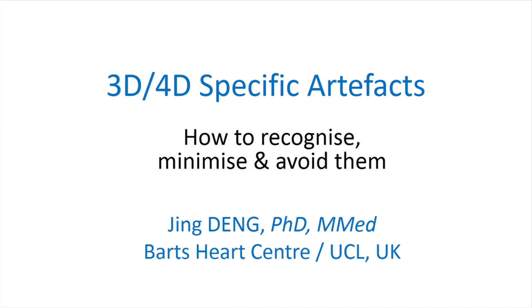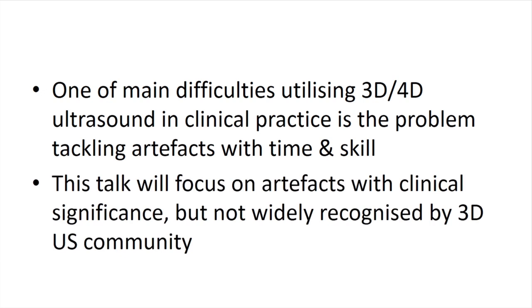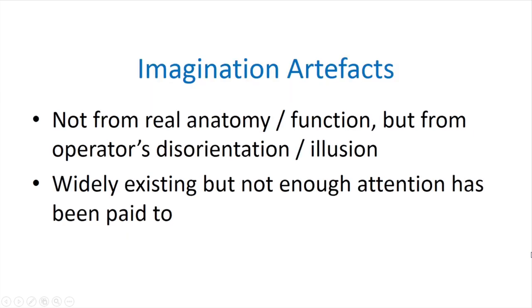Some are widely recognized, but some are not. So I'm focusing on those artifacts with clinical significance that are not widely recognized by the 3D community.